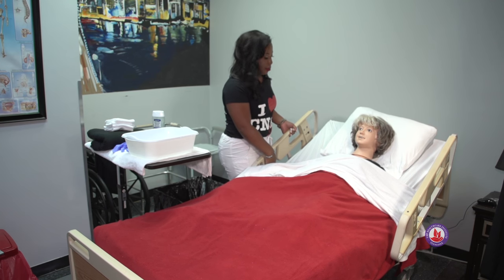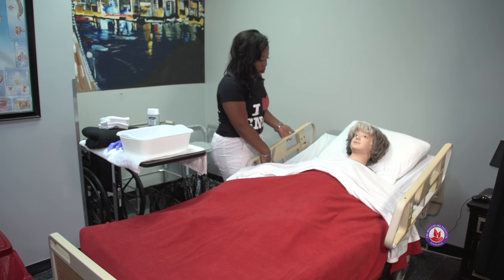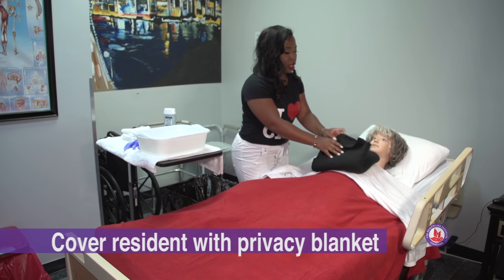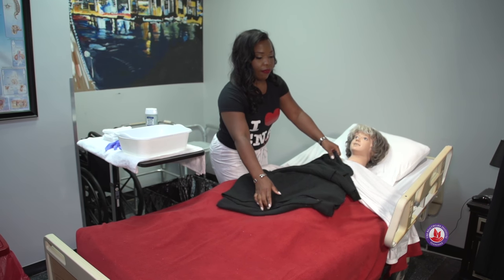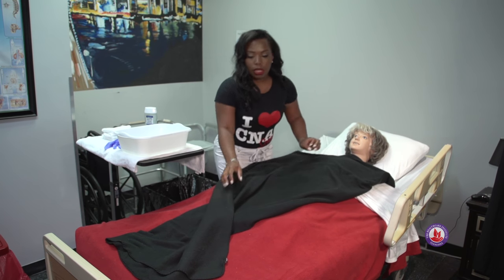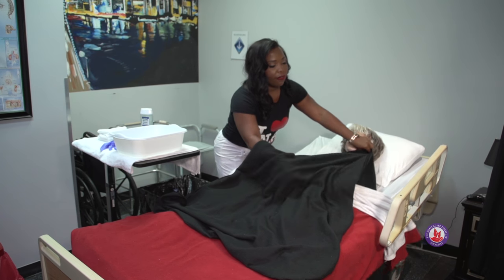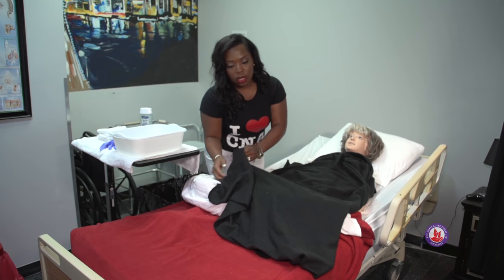We can also recline our resident. We want to make sure that we keep the resident covered at all times, so we'll go ahead and place our privacy blanket. Whenever you place the privacy blanket, make sure that you are not shaking it or fanning it — just unfold it lightly on the resident. The purpose of the privacy blanket is to keep her covered except for the areas in which we're working. After you've placed the privacy blanket, fan fold the covers down only to expose the area in which we're working.